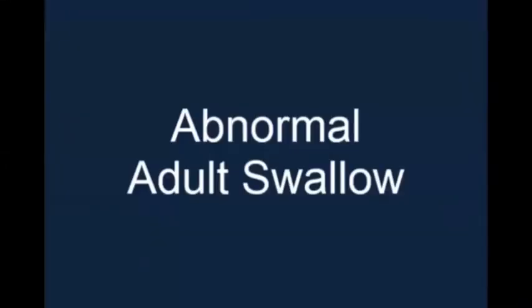And here is an abnormal adult swallow. Swallow happens, but it's not nearly as bad. Oh, okay, stop. Did you see that? Did you see the aspiration? Swallow happens, but it's not nearly as bad. So there was excessive pooling. Some is going down the right way, but some is actually going anteriorly past the level of the vocal folds down into the airway. There you can see the trace down the anterior portion of the trachea here.